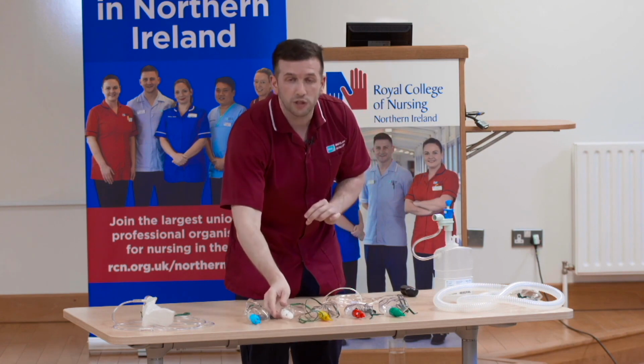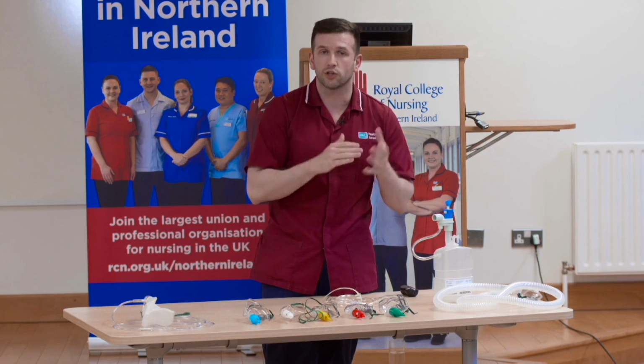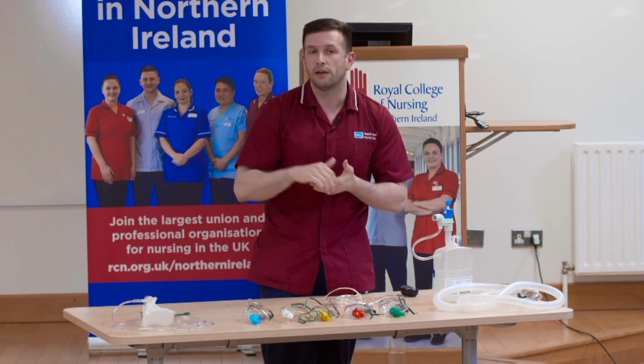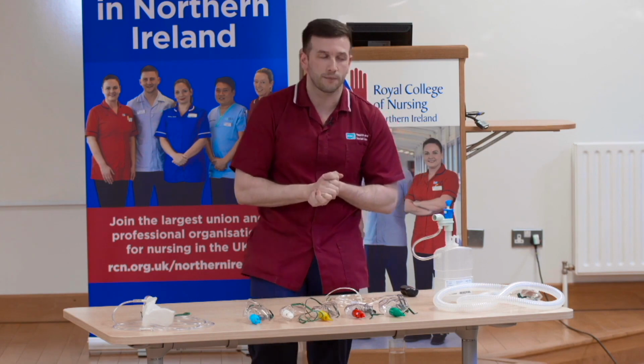Sometimes there's apprehension when you increase the oxygen litres that you're going to increase the oxygen concentration, particularly for those individuals who are oxygen sensitive or CO2 retainers. But with the Venturi barrel, if you increase your oxygen flow rate, you will not change the oxygen concentration.